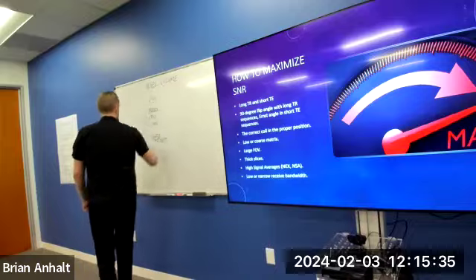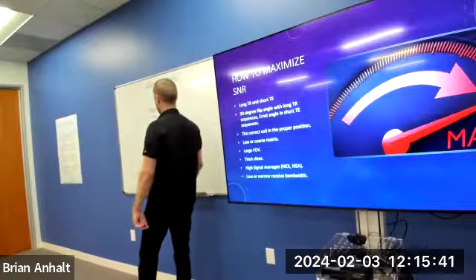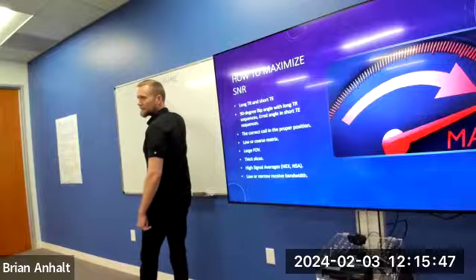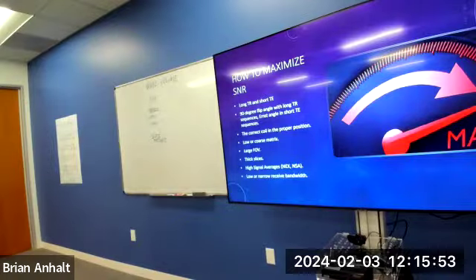So if you're given these three things, which is four numbers, because matrix is two different directions, you should be able to figure out voxel volume. And if you're given these two, you should be able to figure out pixel area, right? Does everyone know the difference between area and volume? Area is the amount of space in two dimensions. So how much area does this tabletop have?